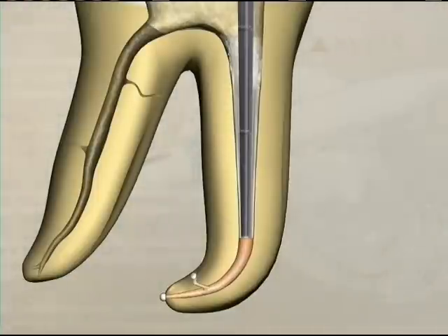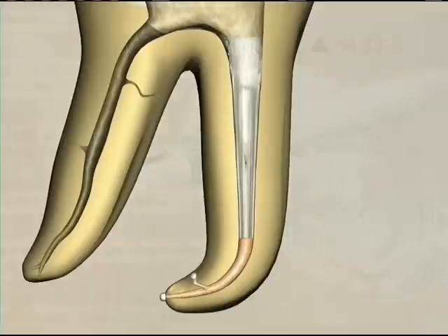The plugger is then removed, showing a completed down pack obtained with the vertical condensation technique, which is ready for backfilling.